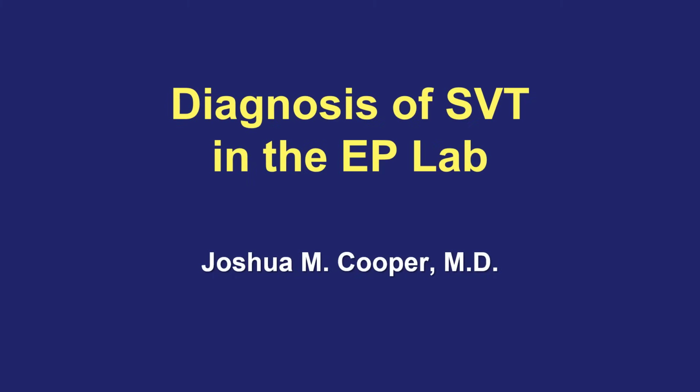Hi, this is Dr. Joshua Cooper, and this presentation is on the diagnosis of SVT in the EP lab, usually for the purpose of catheter ablation.